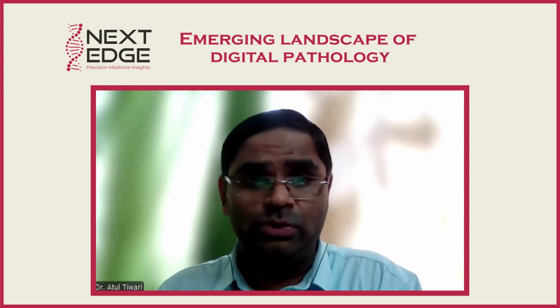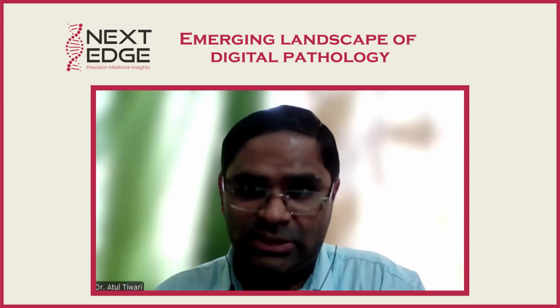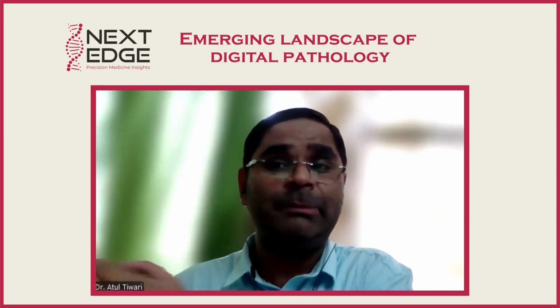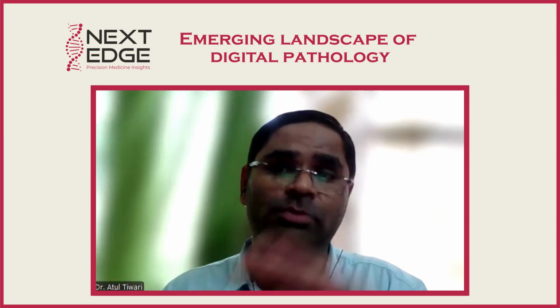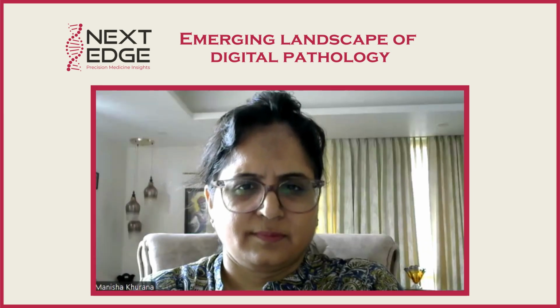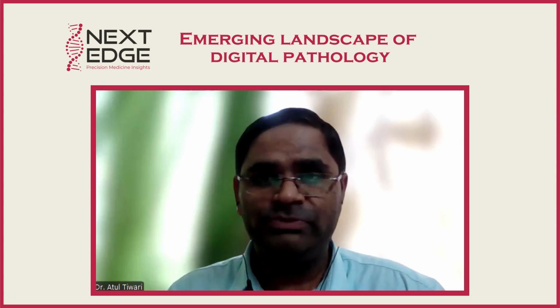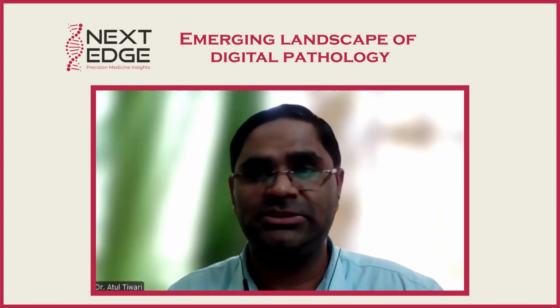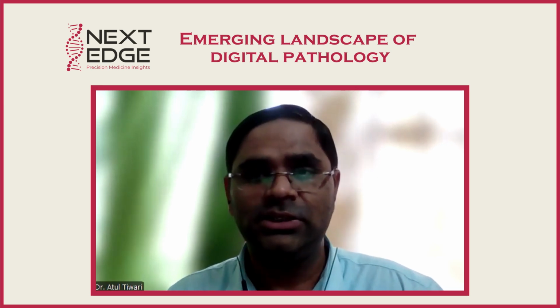What this GAN can do, at least in research, it has shown ER, PR, HER2/neu images just from the H&E image of breast carcinoma. One can just imagine how AI can be so good that, without needing any IHC, it can generate IHC images. This is called virtual IHC.